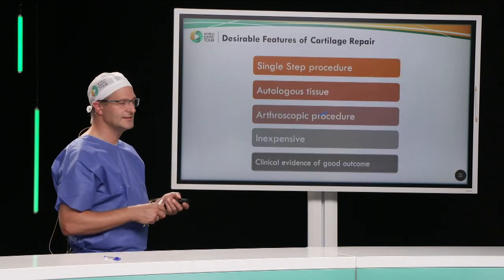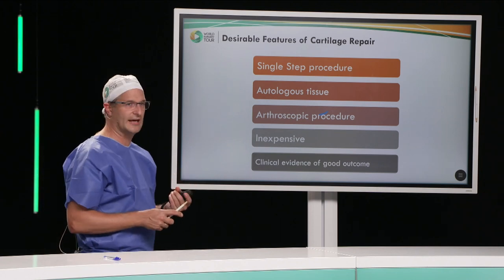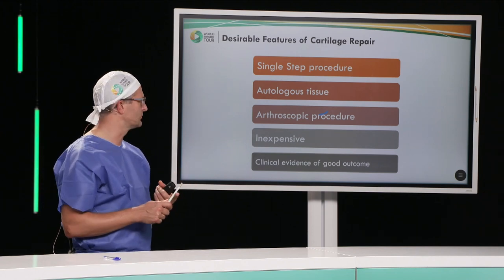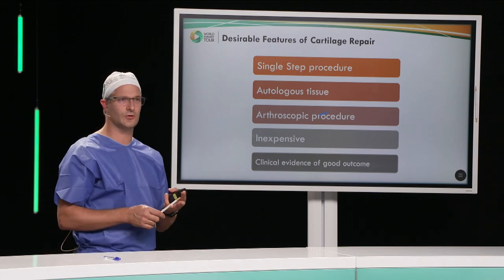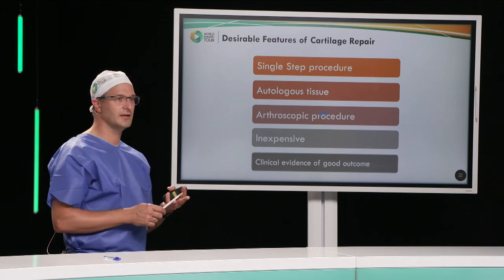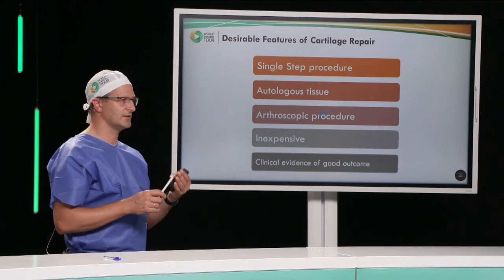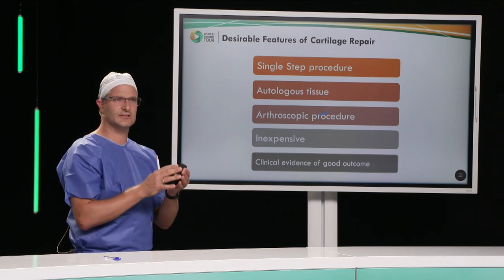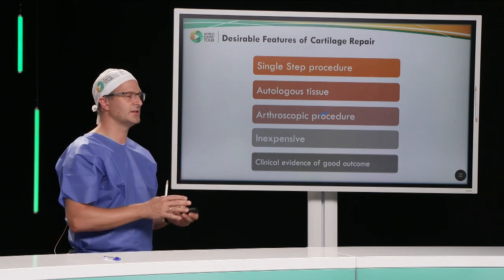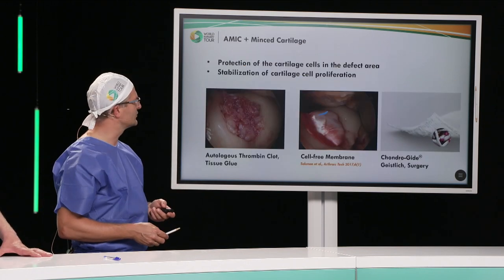So the ideal procedure you would envision is a single-step procedure. Ideally, you use autologous tissue. It should be done arthroscopically. Ideally inexpensive, no culturing required. And you want to have already some existing clinical evidence that this technique is most likely going to provide a good clinical outcome. And that is why the AMIC technique is now being combined with this minced cartilage procedure.